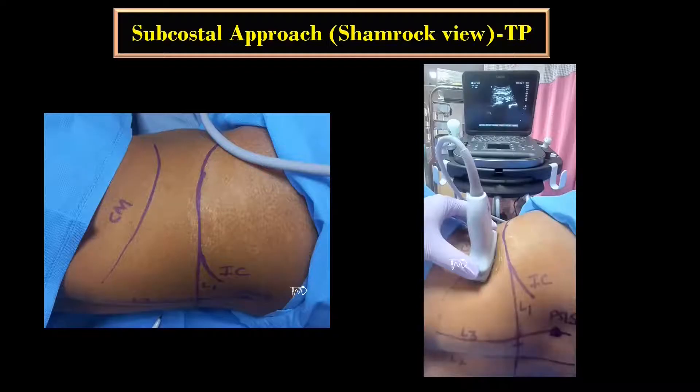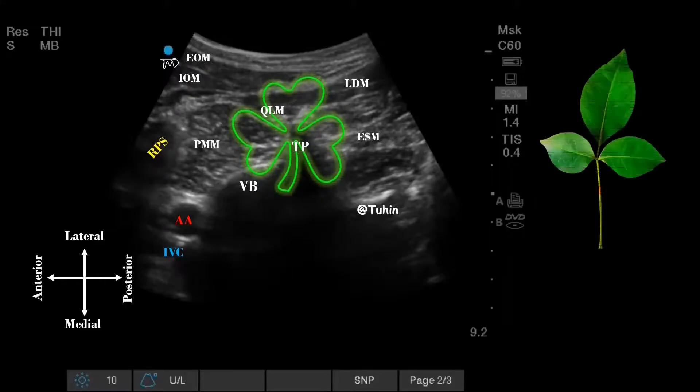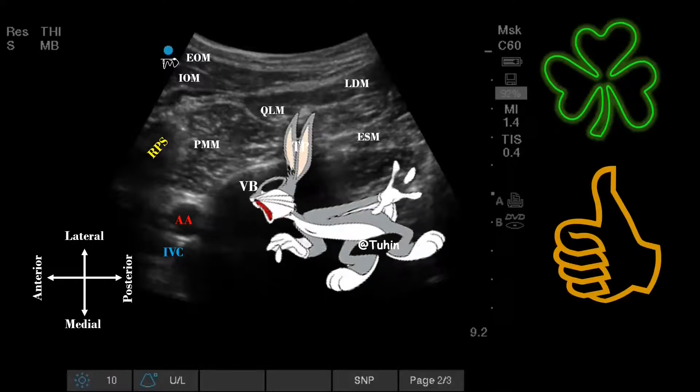The vertebral level at which you are going to perform the block can be identified by midline scanning, similar to the scanning technique for the neuraxial block. Once you identify the L4 transverse process and the vertebral body, then look for the QL muscle at the apex, psoas major muscle anteriorly, and the erector spinae muscle posteriorly. All these structures together form the pattern of a shamrock with three leaves and stalk, or the Indian bell leaves. You can also remember these as the thumbs up sign — where the thumb corresponds to the transverse process and the knuckles of the fingers form the vertebral body — and the bunny head sign, where the ears of the bunny form the transverse process and the head and face form the vertebral body and the major vessels in front of it.